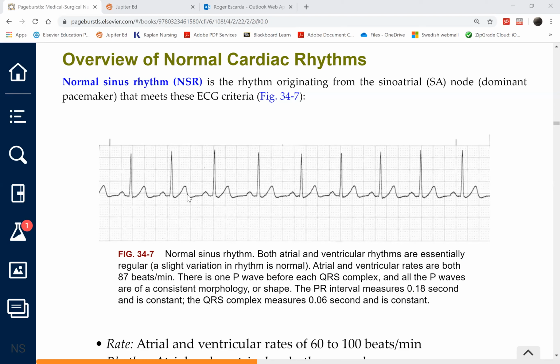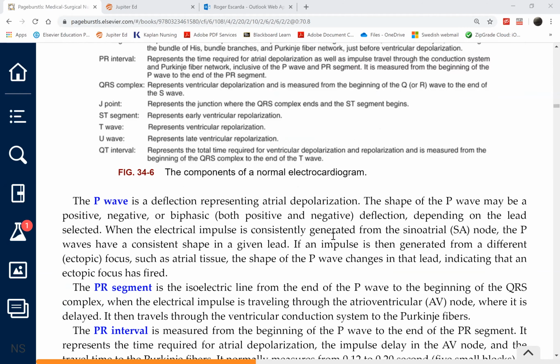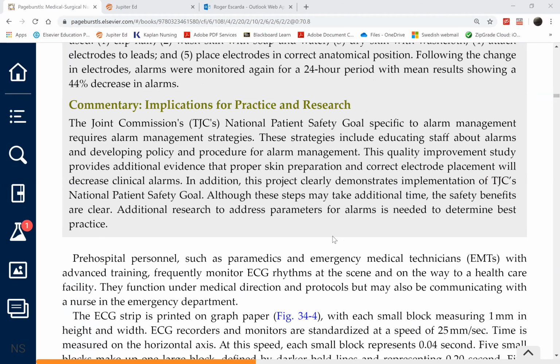You see how this P wave left that imaginary straight line, rose up, and then fell back into it before it proceeded to form another complex? Yeah. So there's an imaginary straight line somewhere along here, and that is called the isoelectric line. Iso, and then electric. The isoelectric line represents a period of no electrical activity.